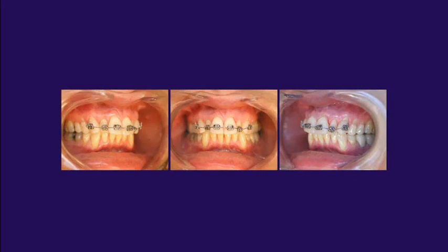We went ahead and we treated this patient from canine to canine on the upper arch, as the goal was to correct a lateral incisor and just some overall alignment issues.